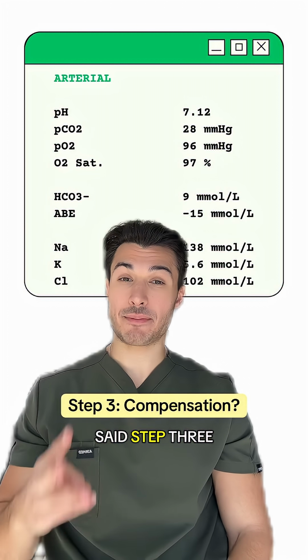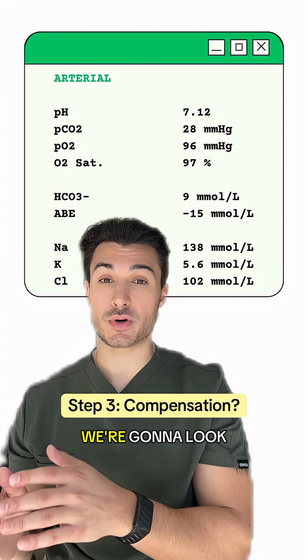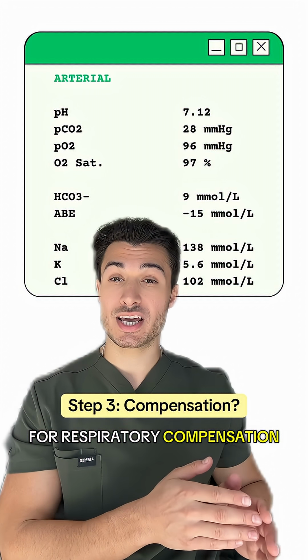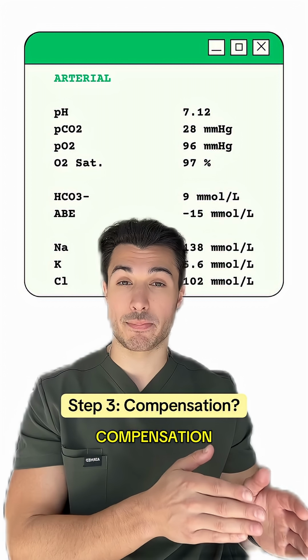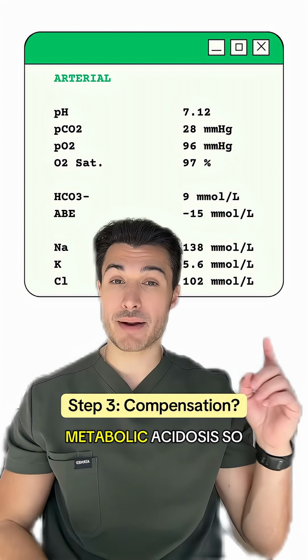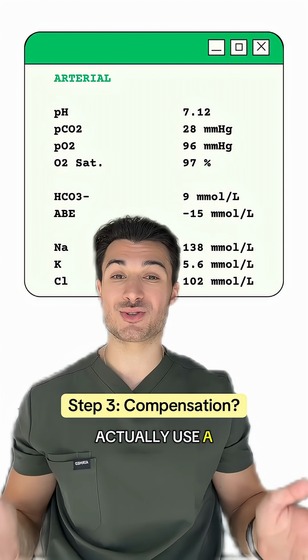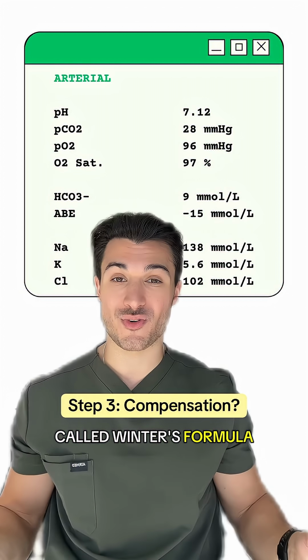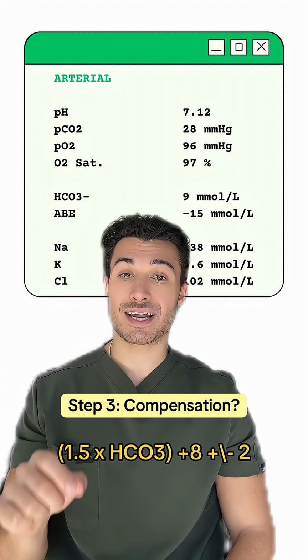Now, as I said, step three is to look for compensation. Now, if it's a primary metabolic disturbance, we're going to look for respiratory compensation. If it's a primary respiratory problem, we're going to look for a metabolic compensation. Now, in this case, we have a metabolic acidosis, so let's look for respiratory compensation, and we can actually use a really clever formula called Winter's formula, which is 1.5 times the bicarbonate plus 8 plus or minus 2.